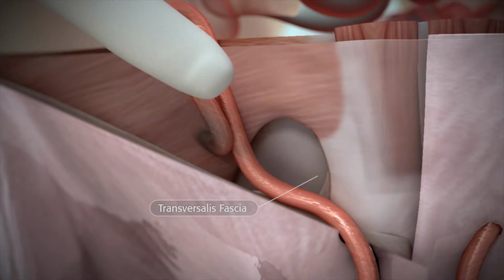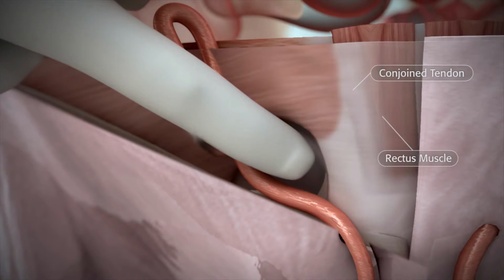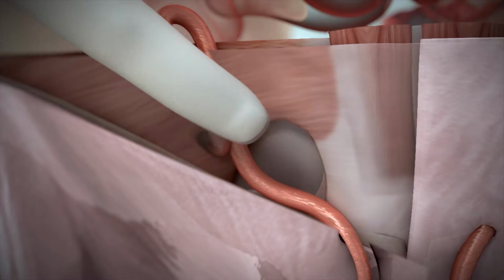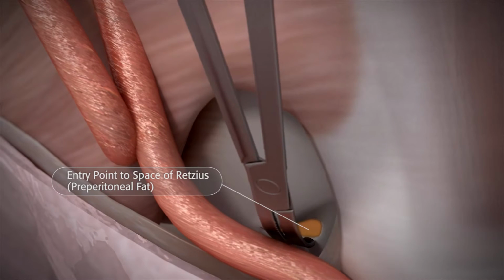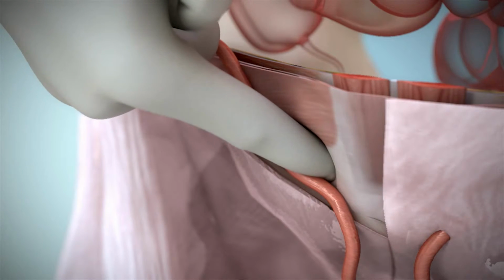Digitally explore the transversalis fascia down to the pubic bone and obliquely enter the space of Retzius. This can be done by either digitally dissecting through the fascia or with the use of an appropriate surgical instrument to gently spread the fibers before digitally penetrating through the transversalis fascia.